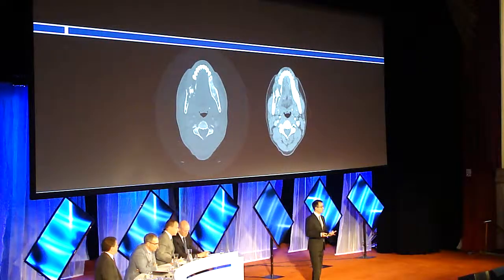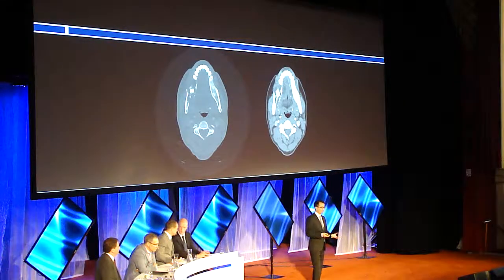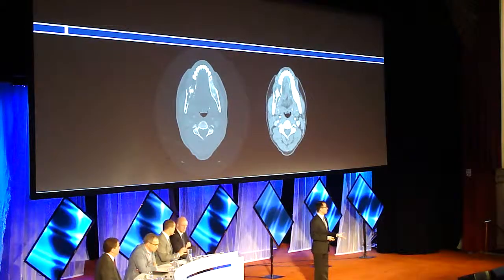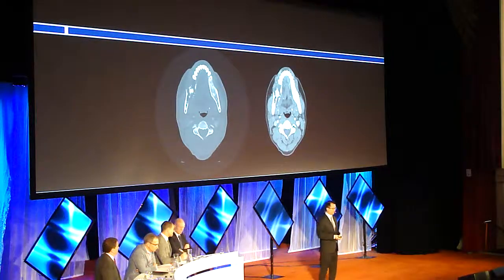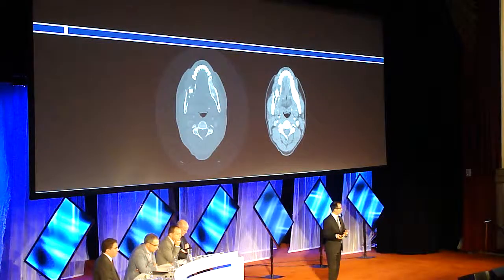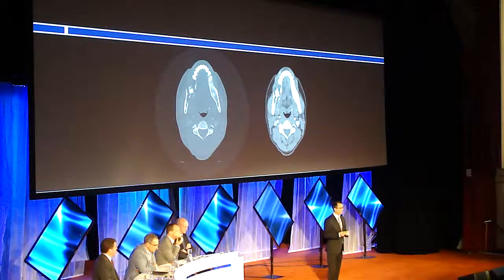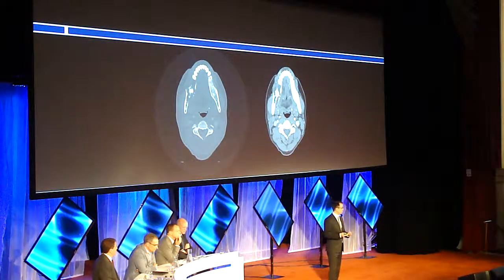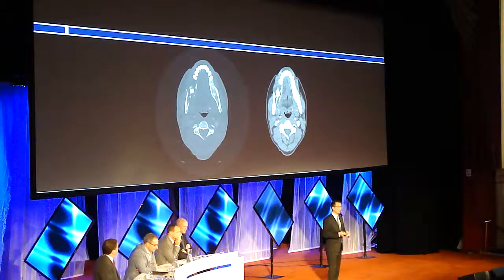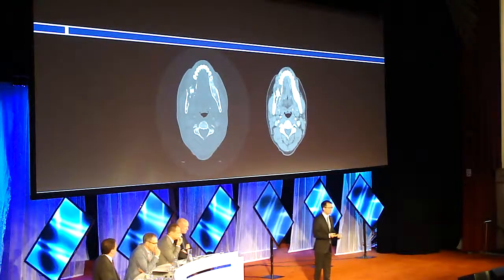So just as a demonstration of why that might be interesting. On the left-hand side, this is a medical CT study. On the left-hand side, this is the bone window view demonstrating a tumor in the right posterior mandible. This is just a classic ameloblastoma. And on the right-hand side, this is the same patient where we've asked the computer to show us the soft tissues. And you can see very nicely how the soft tissue tumor extends out into the adjacent fat underlying the skin.